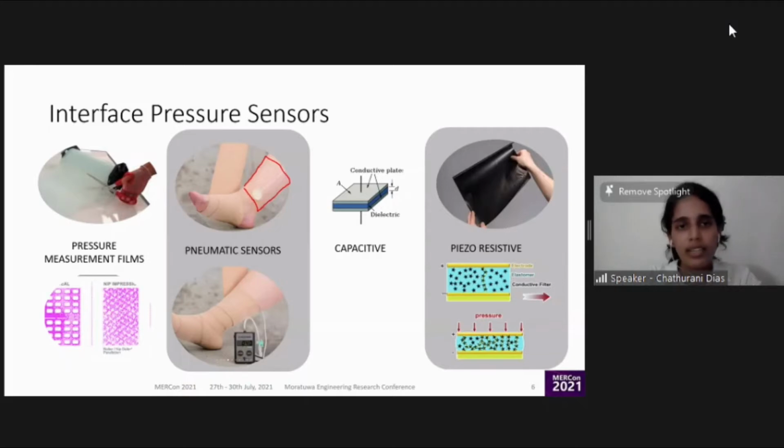So, the advantage is that both capacitive and resistive sensors are actually materials. It can be a polymer, it can be a textile, but the main quality is that when pressure is applied, the electrical capacitance or the resistance of that material will change. So a designer has the flexibility to have resistor matrices or capacitive matrices and read all sensors with a single readout circuit when mapping out one area.